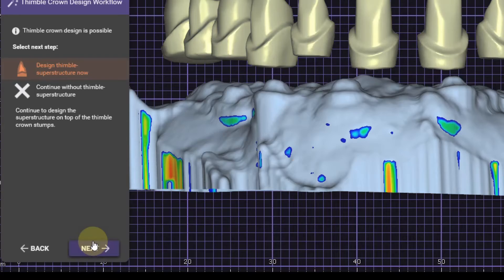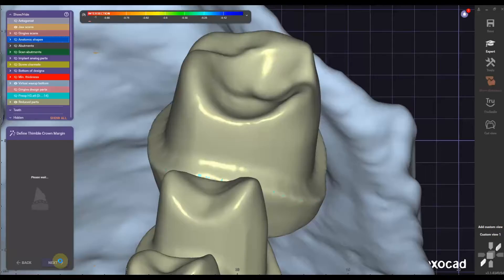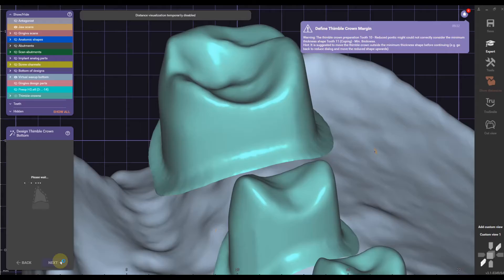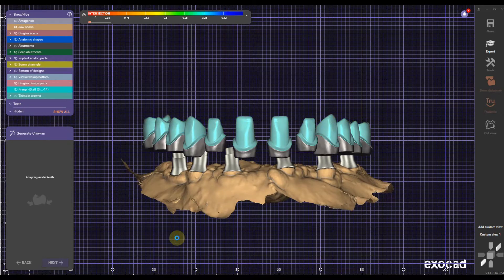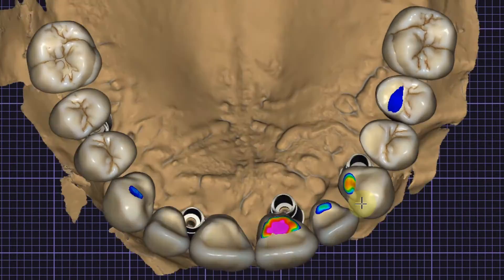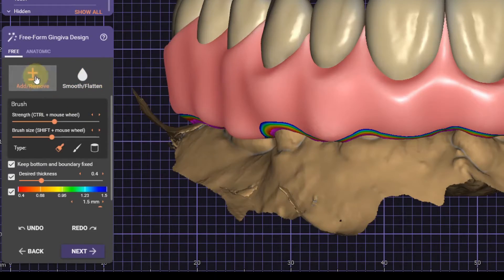Back in wizard mode you can now design the thimble superstructure and Exocad does a perfect job assigning the margins to each thimble crown. On the abutment sides you have to fine-tune them a little bit sometimes if the margin is intersecting with the screw hole, but for the most part you can then go one last time into the gingival design mode where you can fine-tune the gingival one last time. Here I'm primarily focusing on the root structure.